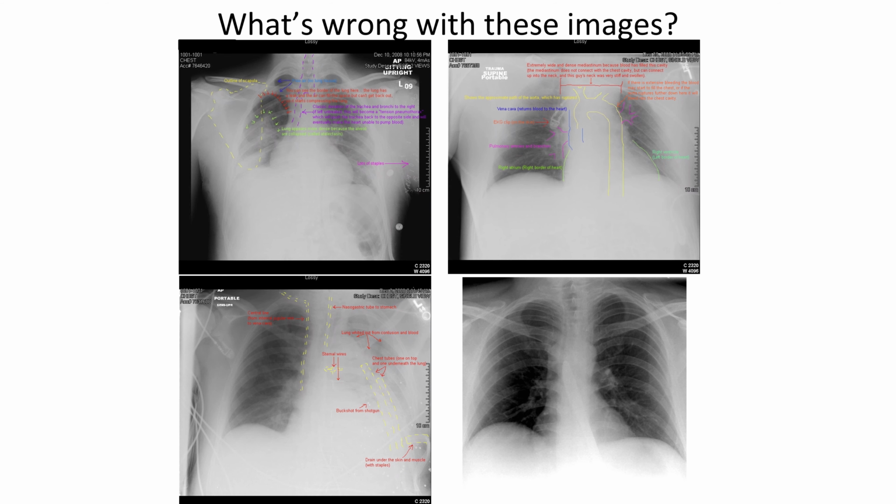So those are just some basic chest X-rays. You can determine a lot just through a simple chest X-ray. Now imagine if we can turn this into a high-resolution 3D image. That would make a powerful tool in medicine for all sorts of things.